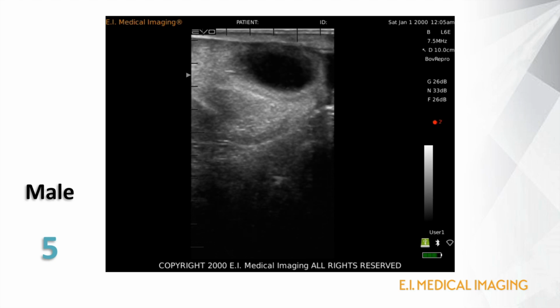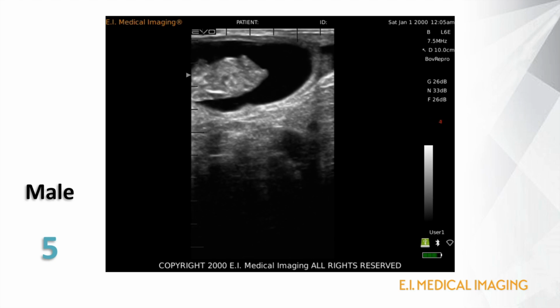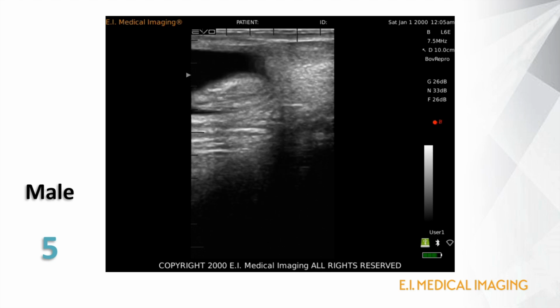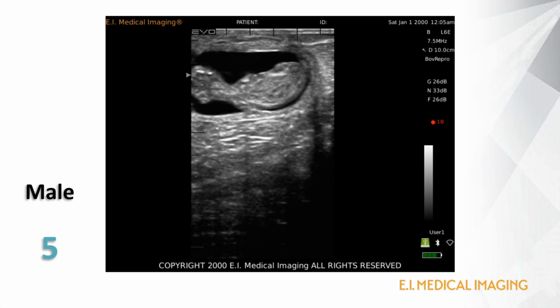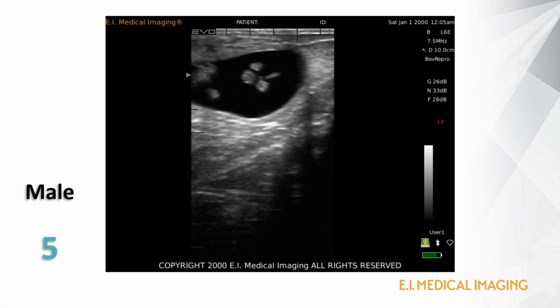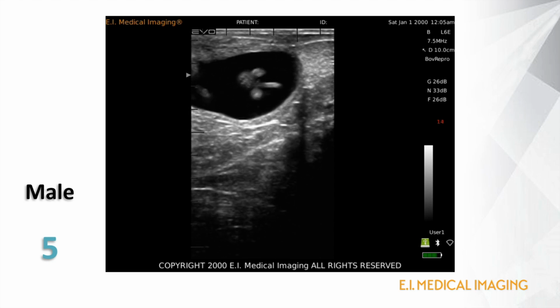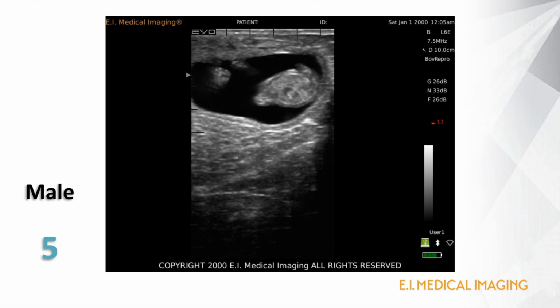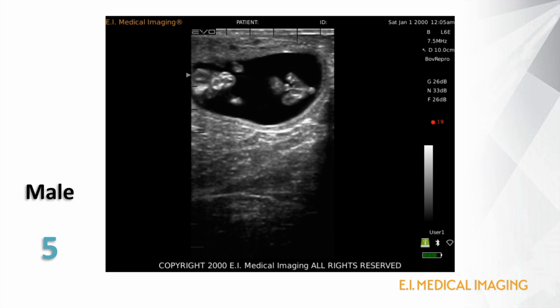Number 5. Here's another fetus in the 60 to 65 day window. The clip starts out with the calf in a sagittal view, but it rolls onto its side and we obtain a nice frontal plane. This one also has the tail tucked between the hind legs, but by fanning out of the plane where most of the tail lies, we get a nice view of the ventral abdomen and see the male GT adjacent to the umbilicus. This is a bull calf.